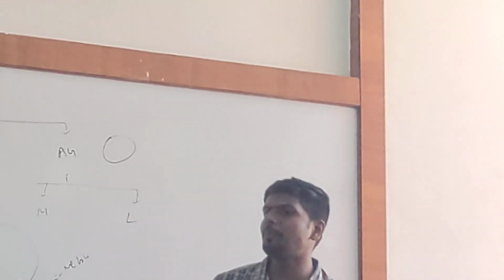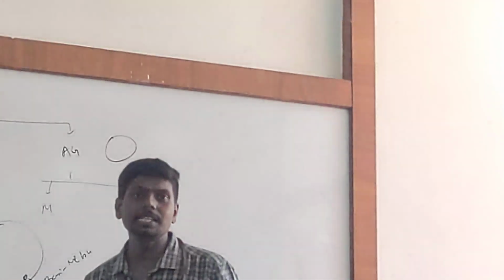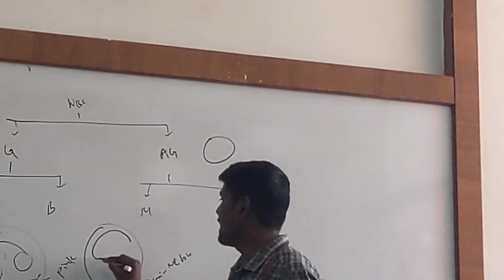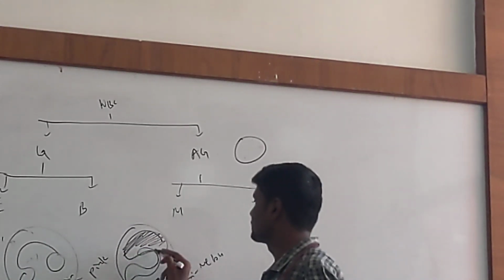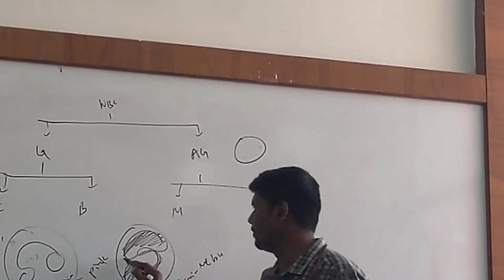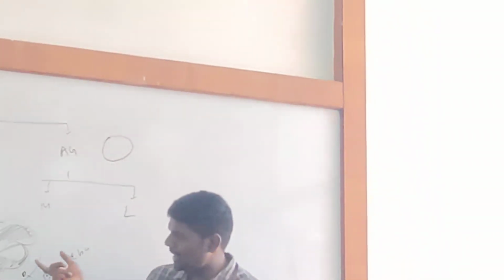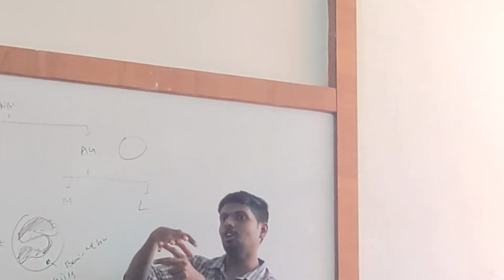And what is the shape of the nucleus? The nucleus looks like a sigmoid shape. An S-like sigmoid shape can be seen in the nucleus. Now there is a problem with the sigmoid-shaped nucleus. This sigmoid-shaped nucleus also looks like a bilobe once the cells are reoriented.